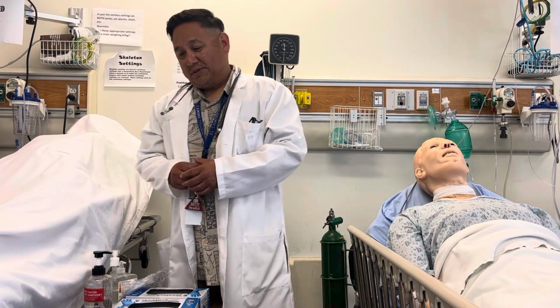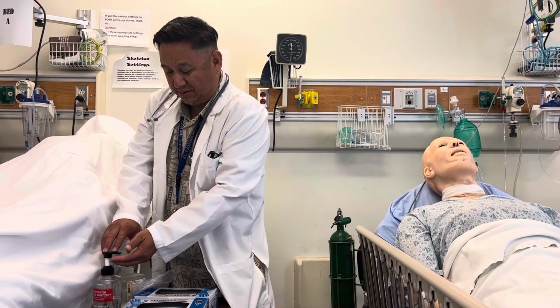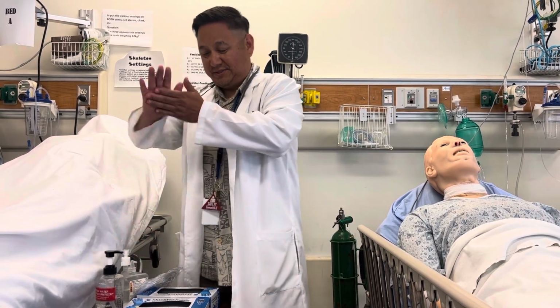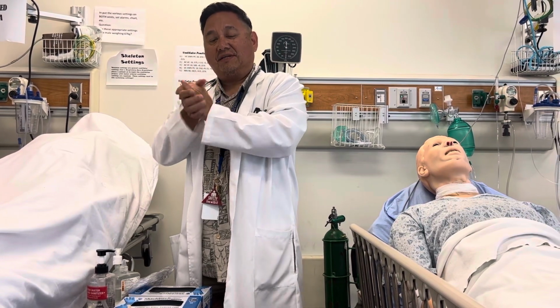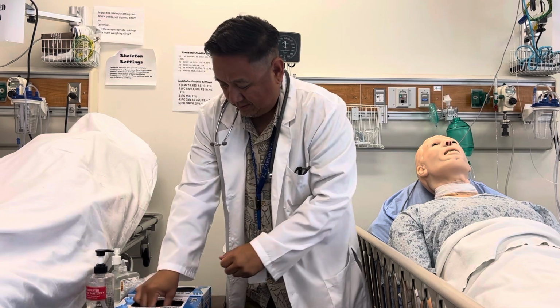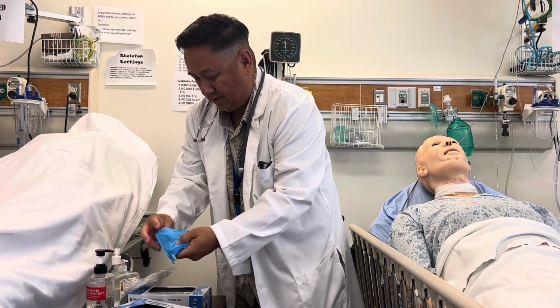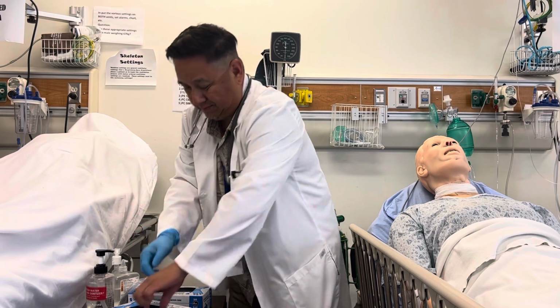Next, I will wash my hands if they are not visibly soiled. I will use 3 mL of sanitizer for at least 15 seconds or until dry. I will then place my gloves on.